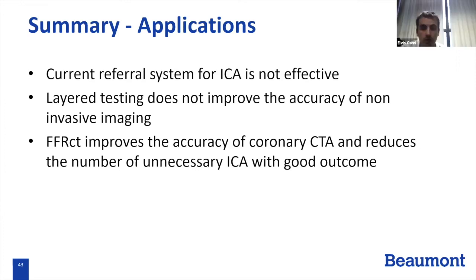So do you feel like this is opening up coronary CT to a lot of calcified patients? Absolutely. We scan 70-year-olds, we scan 80-year-olds with diabetes, with hypertension, very routinely. And without FFRct, I wouldn't be able to tell. If I just see calcium, I can't tell how bad that stenosis is. If you didn't have FFRct, all of these patients would go to the cath lab because you just can't tell.